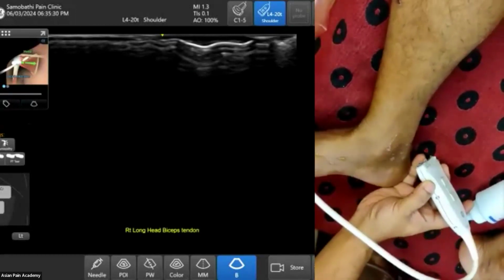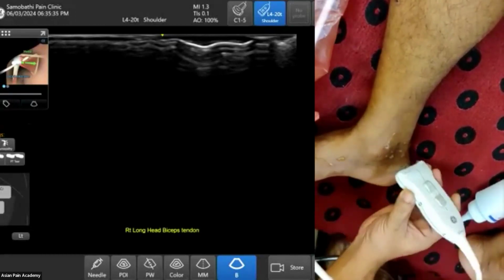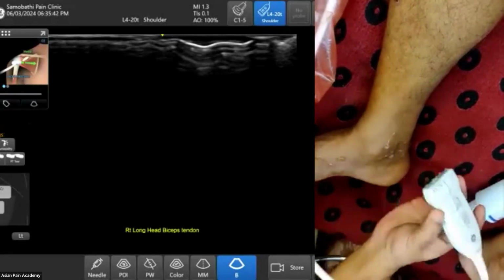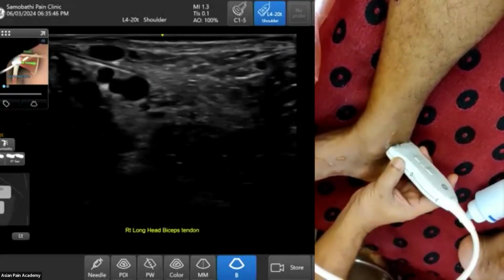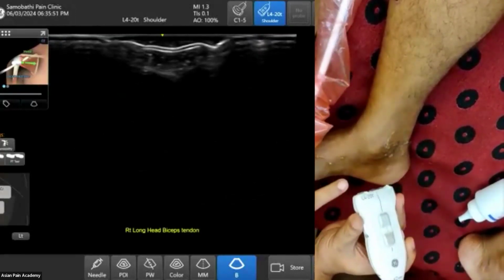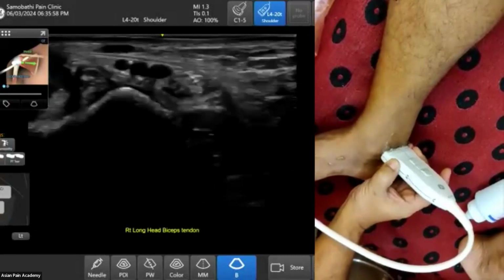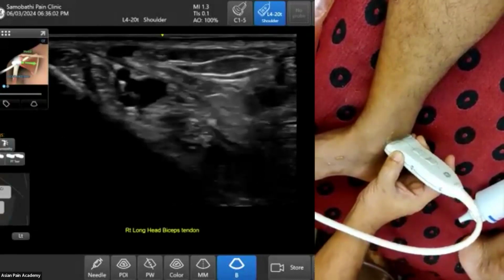Okay, so I am searching for posterior tibial nerve. First, this is the medial side. So I am putting the probe in a transverse orientation. This is a high frequency probe, linear probe. Here in the middle left side of your screen will be the medial malleolus. So here, if I put the probe like this, then what are the things we are seeing?